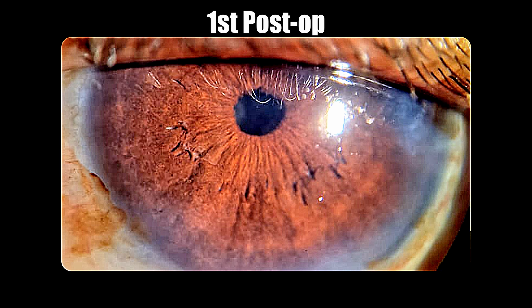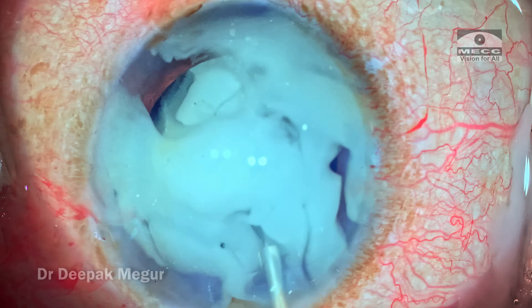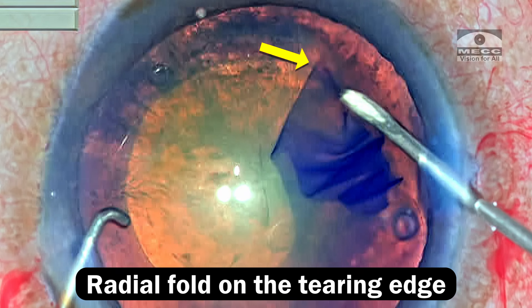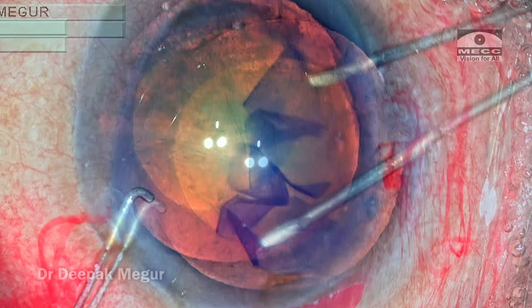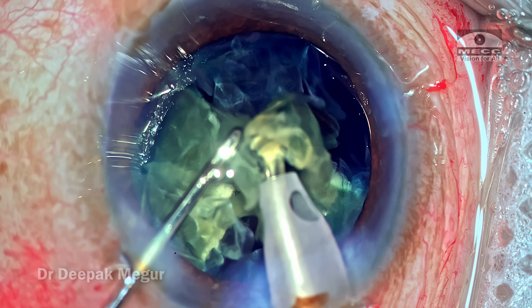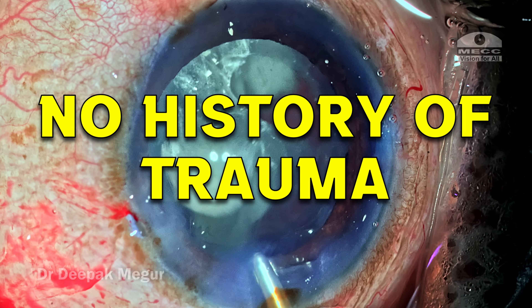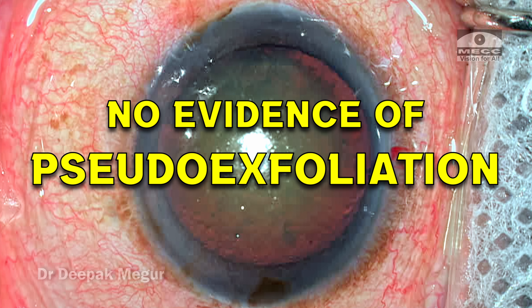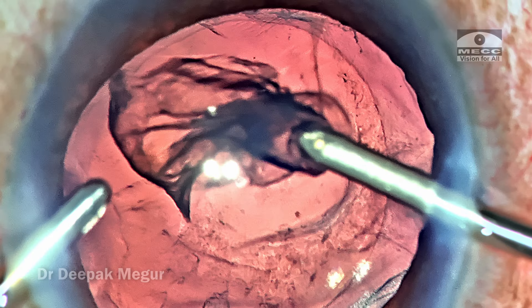On the first post-op day the cornea is clear and the patient is doing fine with an excellent visual outcome. To summarize: you never know when surprises like this will occur. The first indication of compromised zonules is the linear radial folds seen along the tearing edge during rhexis, most evident in the area of zonular weakness. The patient had no history of trauma and no pseudo-exfoliation — so the cause remains unclear. But cataract surgery always has the potential for surprises and we need to be ready to deal with them.